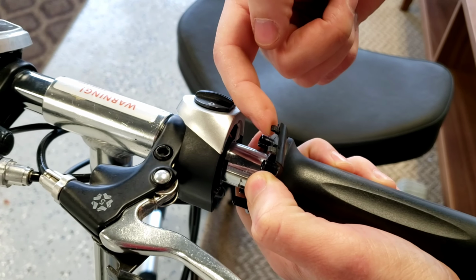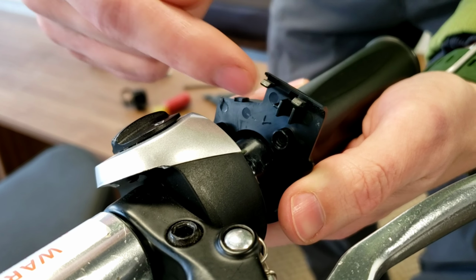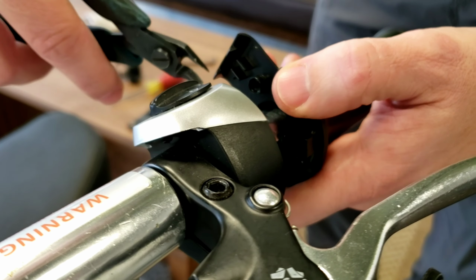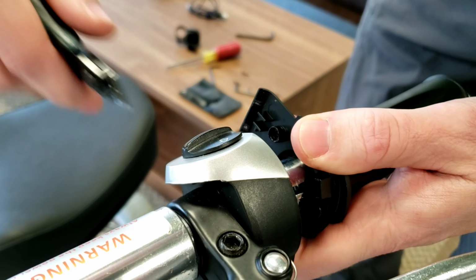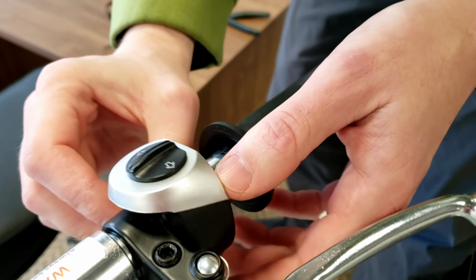And you'll see that there are these two notches. Okay, we don't really need those. So we're going to cut off both sides right there with our clippers and then put it in.